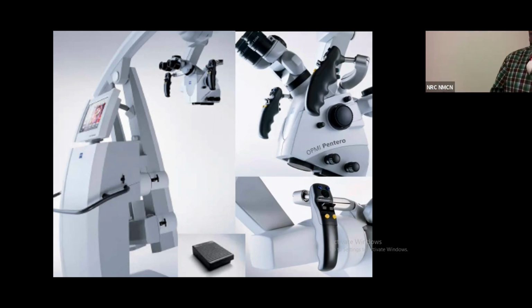Apart from that, you can see that this is a screen out here. These are the components which are present in any of the microscopes. This is the large screen, and it is primarily used for the persons who are observing the surgery from outside, that is the non-scrubbed staff, and also more importantly for the scrub nurse, because it is the scrub nurse who shall be seeing the screen and anticipating which instrument has to be given, and what the likely things are that we shall be needing in the next step or in the subsequent steps.